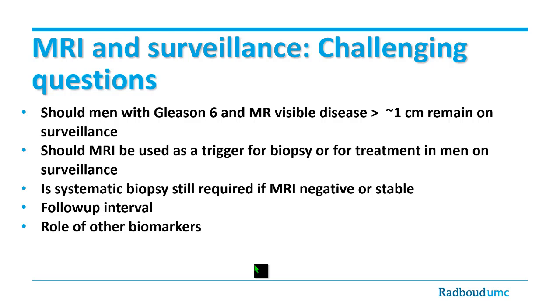Should MRI be used as a trigger for biopsy or for treatment in men on active surveillance? So then we need some criteria. What is disease progression? And is systematic biopsy still required if the MRI is negative? I think based on the literature, we can be quite sure that if you don't see any disease progression, we should not use the biopsy needle. What's the follow-up interval? Most likely not 1 or 2 years, more towards a 3 or 4 years follow-up strategy. And also the role of other biomarkers can be quite helpful, I think, in the selection of patients.